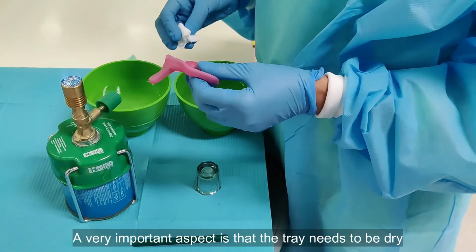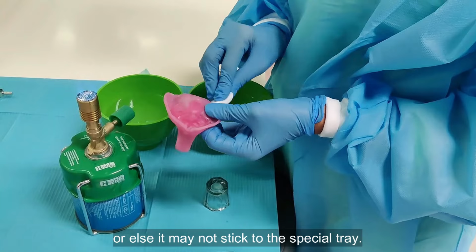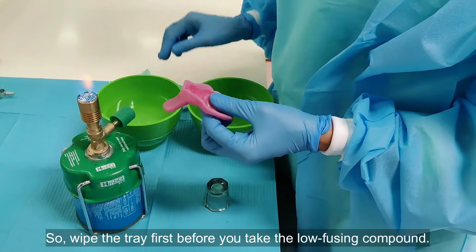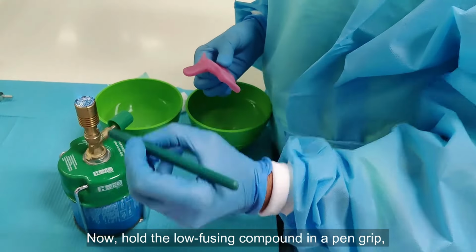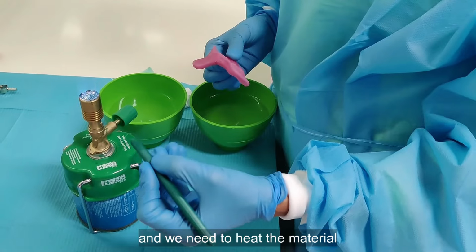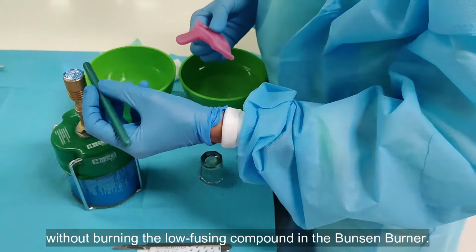A very important aspect is that the tray needs to be dry before we add the low fusing compound, or else it may not stick to the special tray. So wipe the tray first before you take the low fusing compound. Now hold the low fusing compound in a pen grip so that it is firm in your hand, and we need to heat the material without burning the low fusing compound in the Bunsen burner.